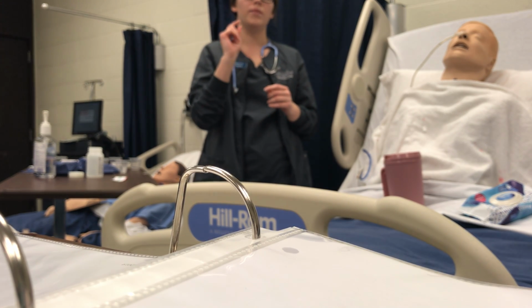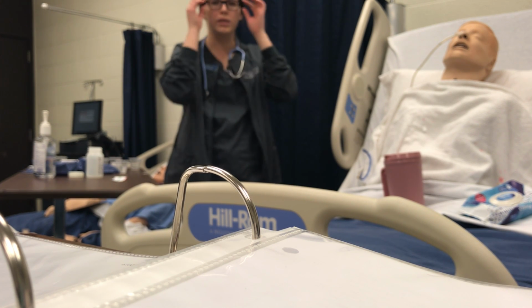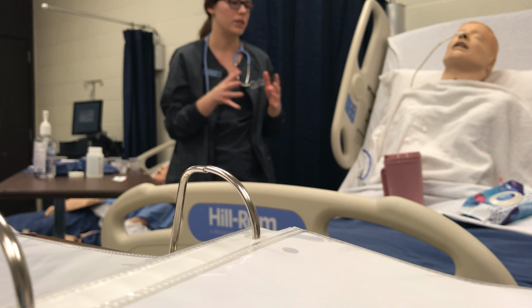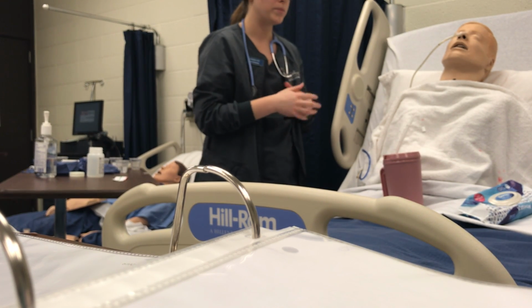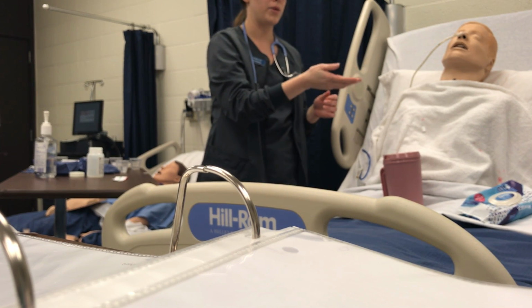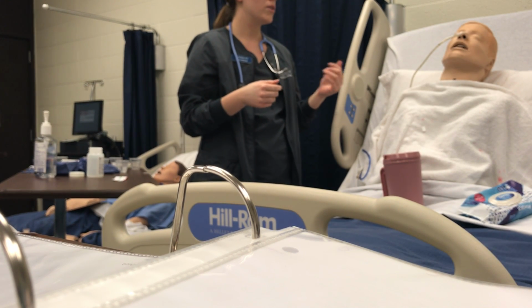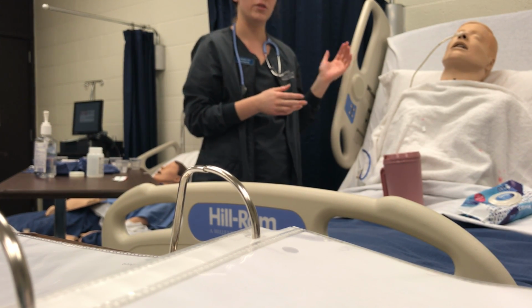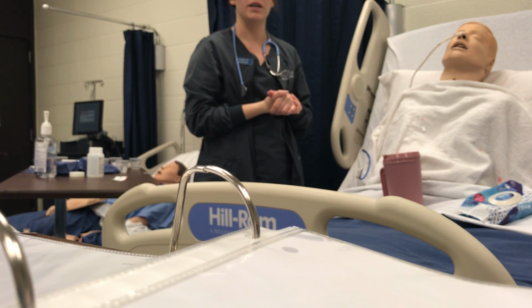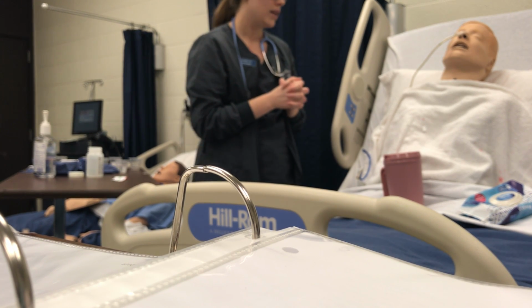And I also didn't note, after I would do the medication administration, I would be sure to not hook it back up to suction for 20 to 30 minutes, or else it would suck all that medication right back out. So that's something that's really important to note with that too. And so with this as well, we're going to make sure that if there's any kind of contents coming out, they will have those Kleenexes there to wipe their nose off with. And also, I would make sure that they didn't do a feeding for about 20 to 30 minutes before I would take the NG tube out, or else that could be a bit messy as well. So I would make sure all of those things were in place.